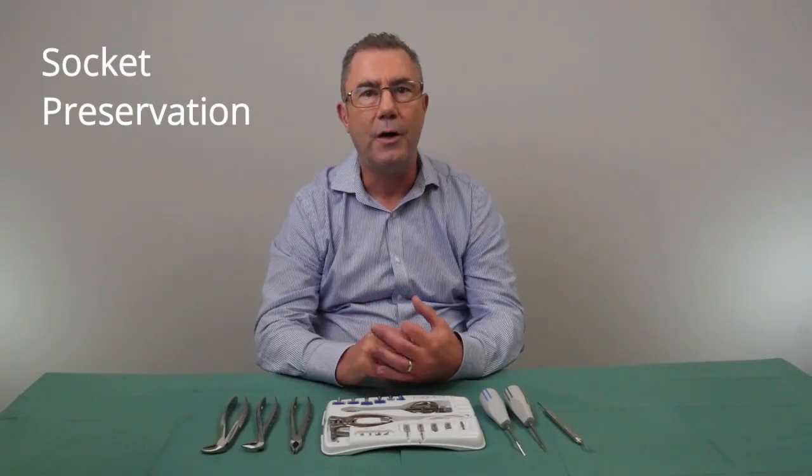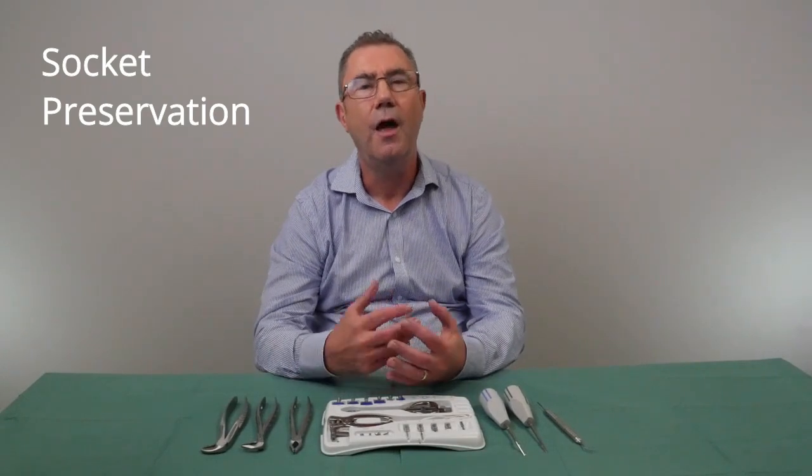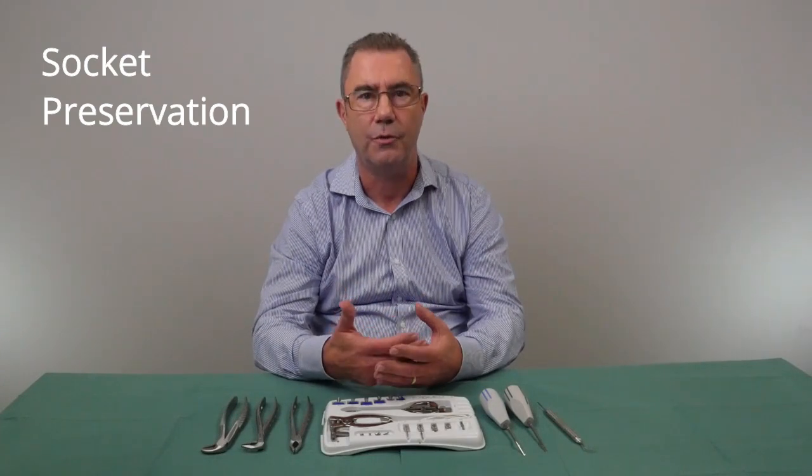Hello, my name is Lloyd Pope and I'm a dentist employed by TriCare in the educational department. I want to talk to you today about socket preservation and some of the materials and instruments that are involved in that treatment option.